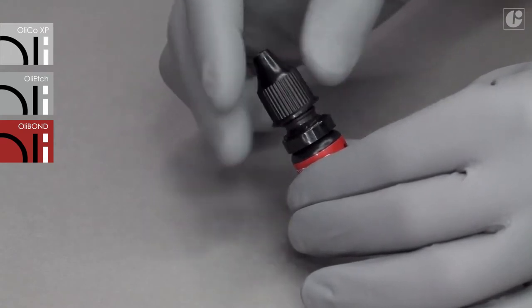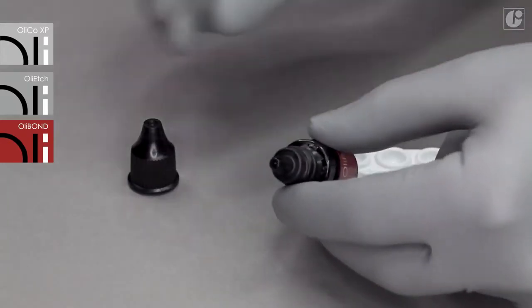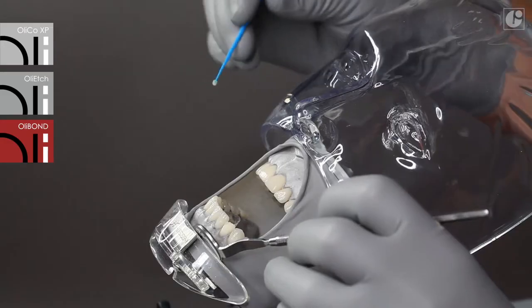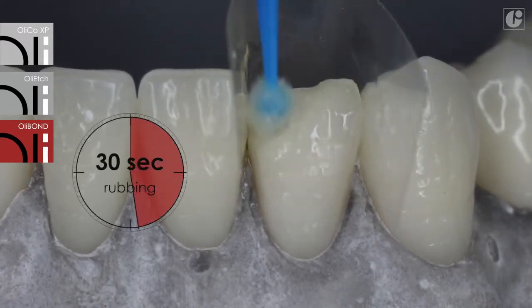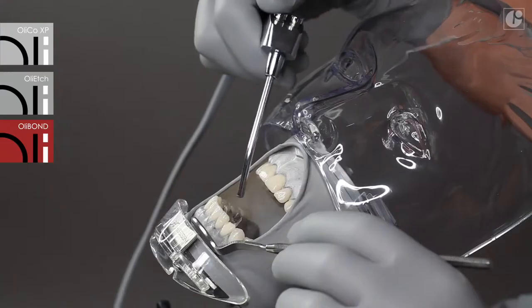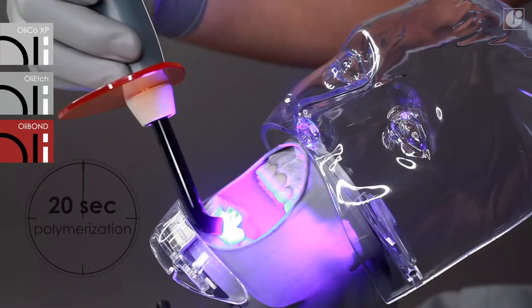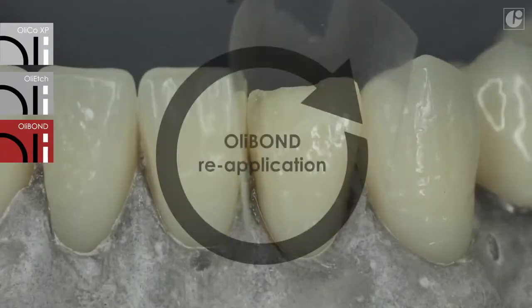For a procedure with OliCo XP, measure out one drop of the OliBond light-curing bonding system. Then rub it into dental tissues thoroughly for 30 seconds using a brush. Dry for 15 seconds with a gentle stream of air to spread the bond across the entire surface. Polymerize with light for another 20 seconds. It is recommended to apply a second layer of OliBond, so the application procedure should be repeated.